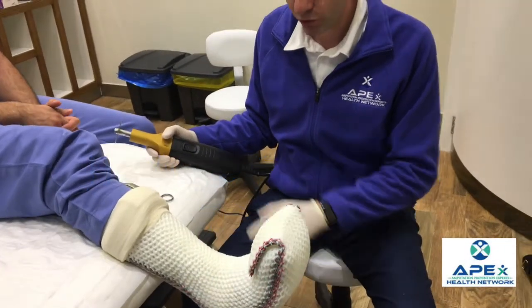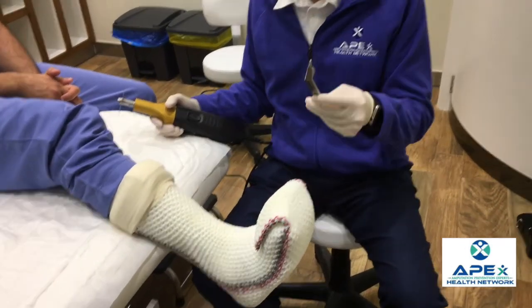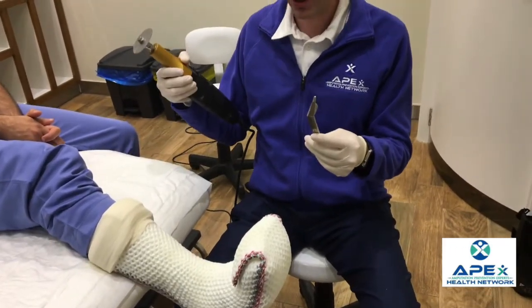We're going to demonstrate the proper way to remove a TCC-EZ. You need essentially two tools: scissors and a cast saw.